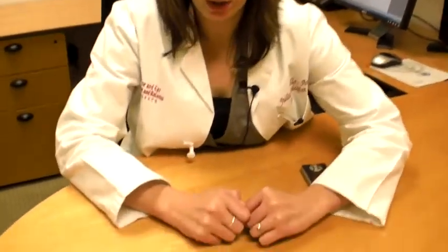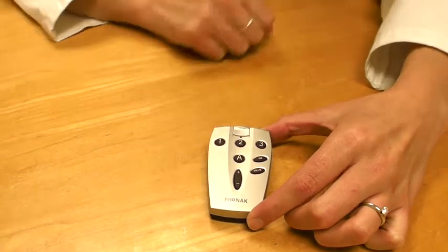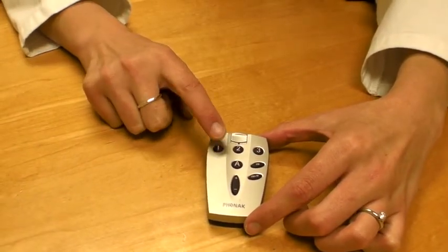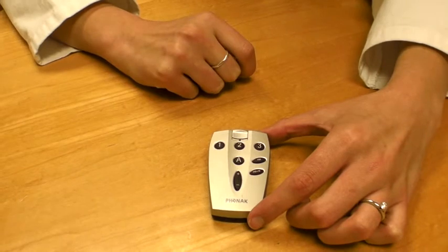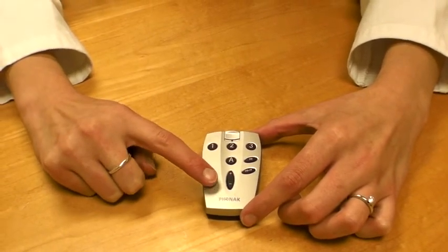Remote controls can be a little bigger. This one has a lock system so you unlock it. You can change from program one, two, or three. You also have the option of turning the volume up or down.